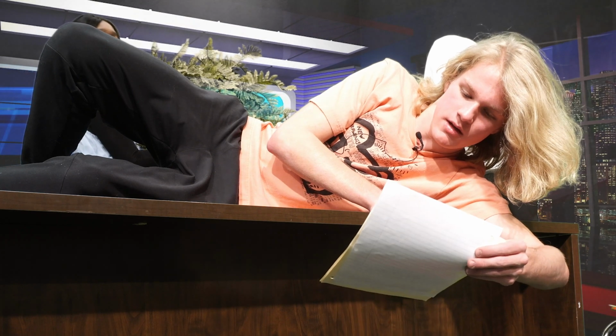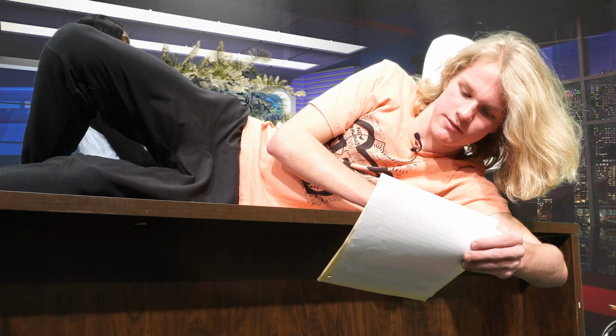An AED uses sophisticated software and hardware to analyze the victim's heart rhythm and determine if a shock is required. The shock is only delivered by an AED machine if a sudden cardiac arrest event is detected, although it's important to back away from the victim if the AED is about to deliver a shock. Most AEDs can be used multiple times and are good for hundreds of shocks, though it is important to replace the pads and batteries when necessary.